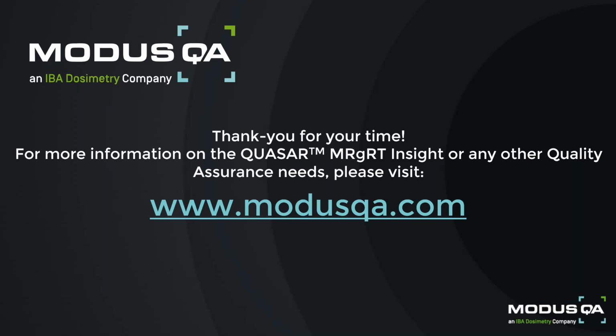We don't currently offer any actual film analyzing services at Modus. We are only here to provide you the tools that you can perform the test with. So usually it's there to help you perform those 2D dosimetry checks if you're interested in film.